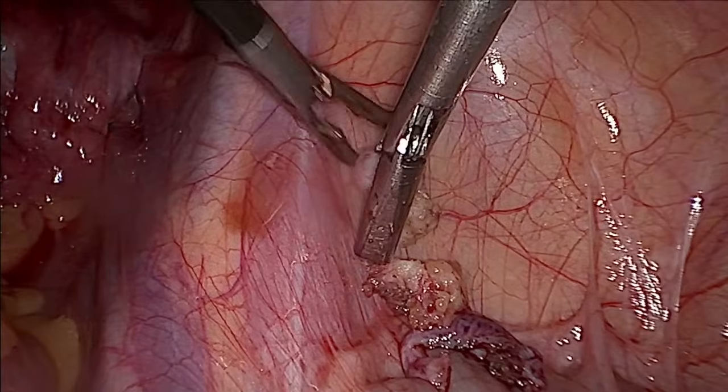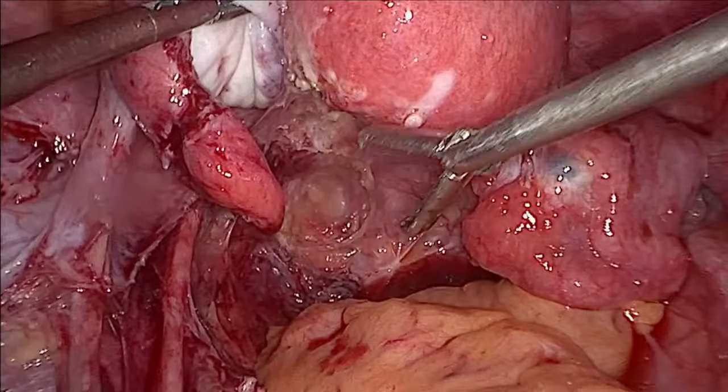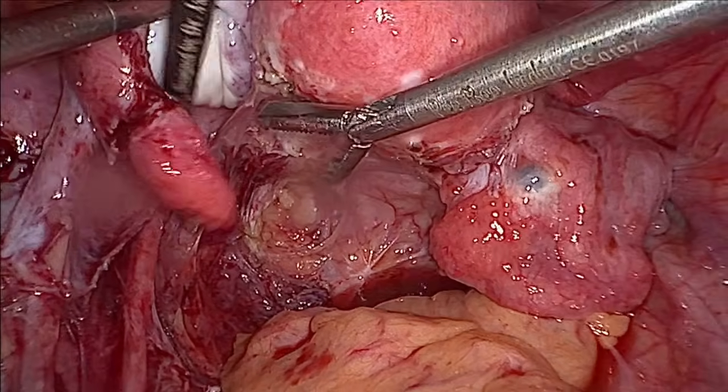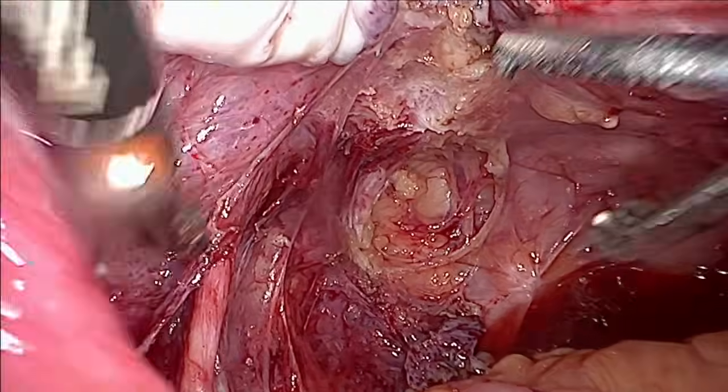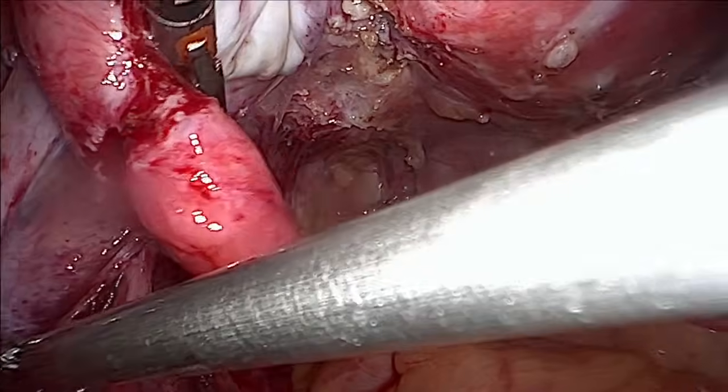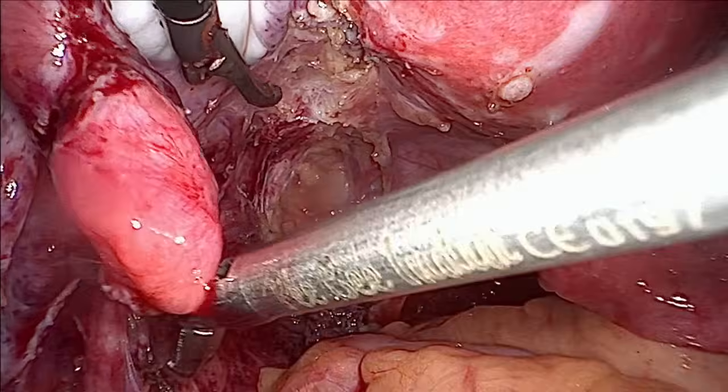Okay, remove the fibroid. Now we can see the ureter is down. It's not in our track, and we can safely go for adhesiolysis here.